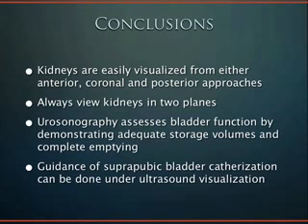The kidneys are really easily visualized, actually. Anterior, coronal planes, even posterior approaches. Today you'll be using all three approaches. You're going to be looking at the kidneys in two different planes, both longitudinal and short axis.